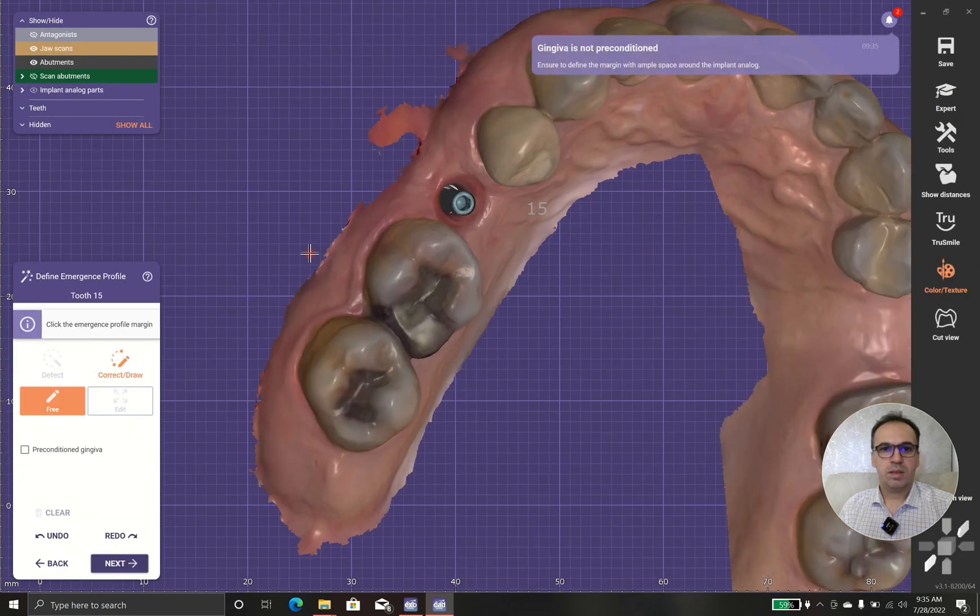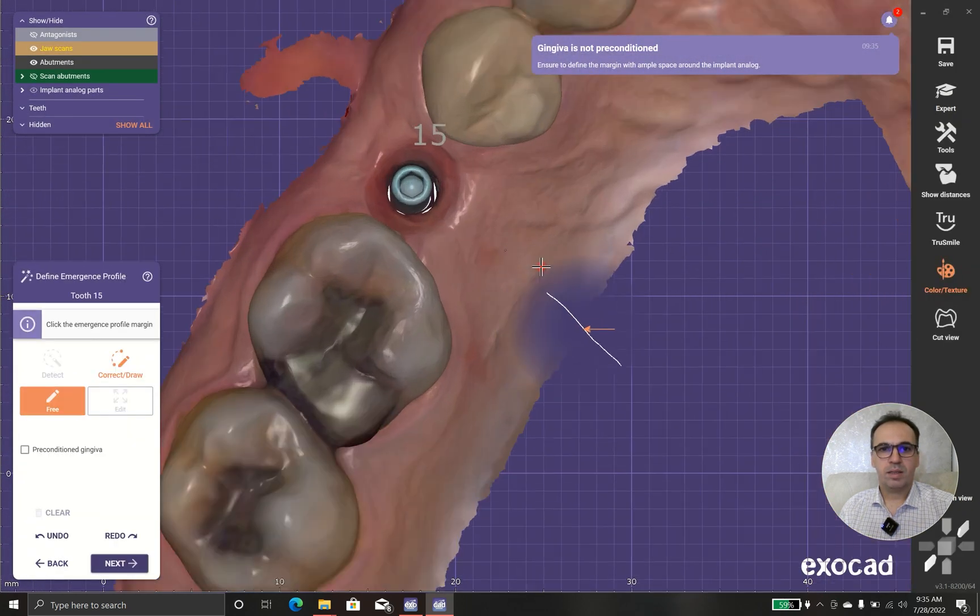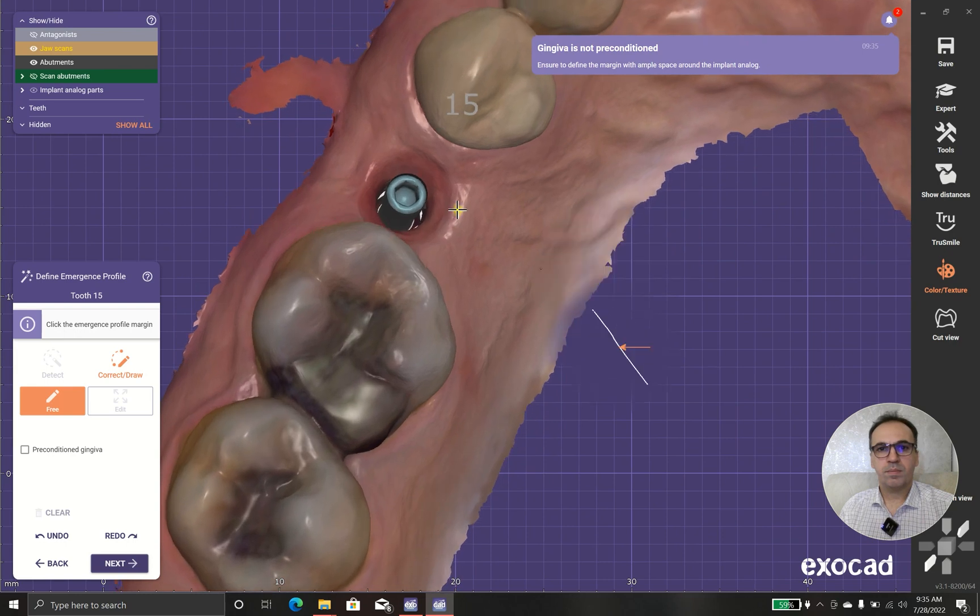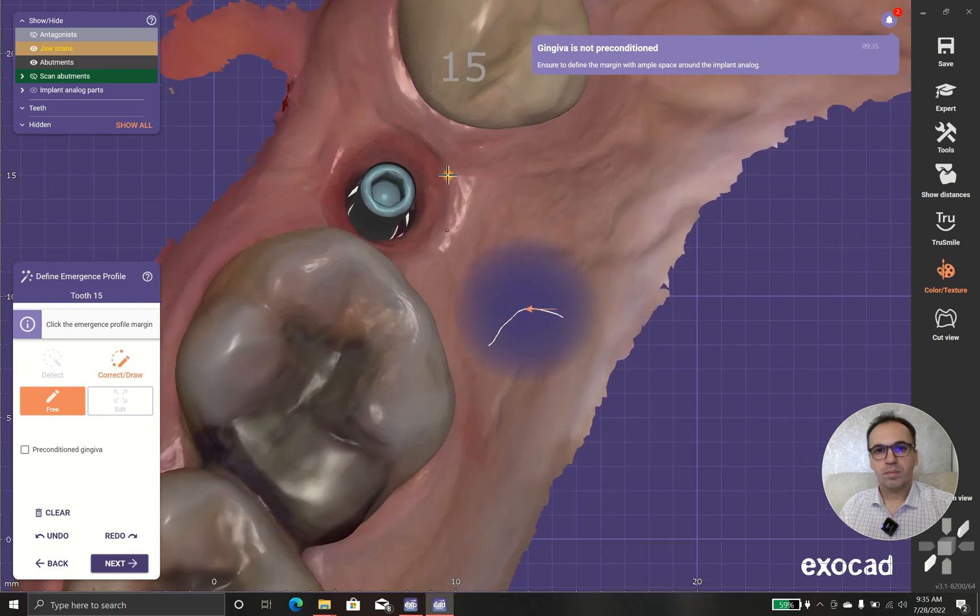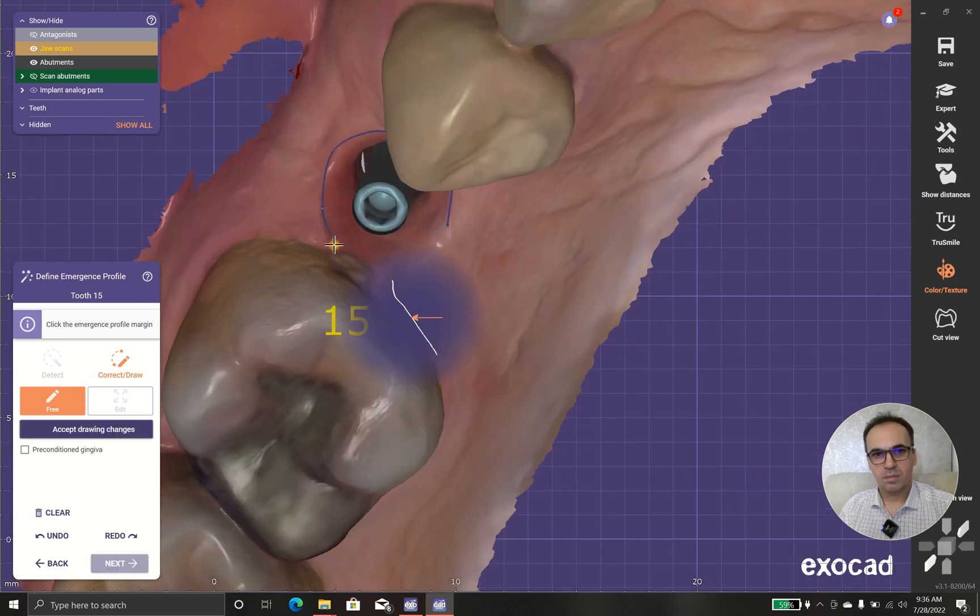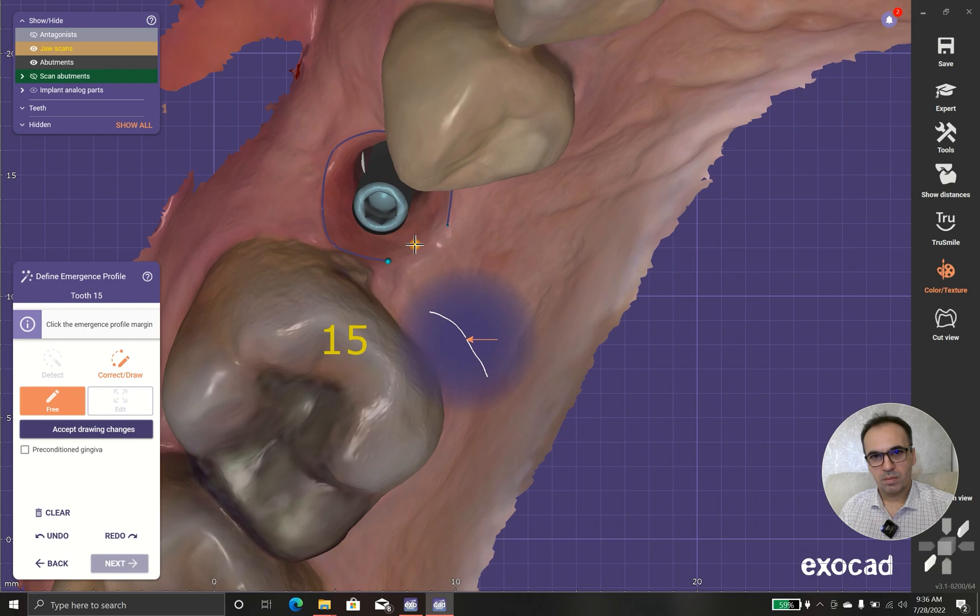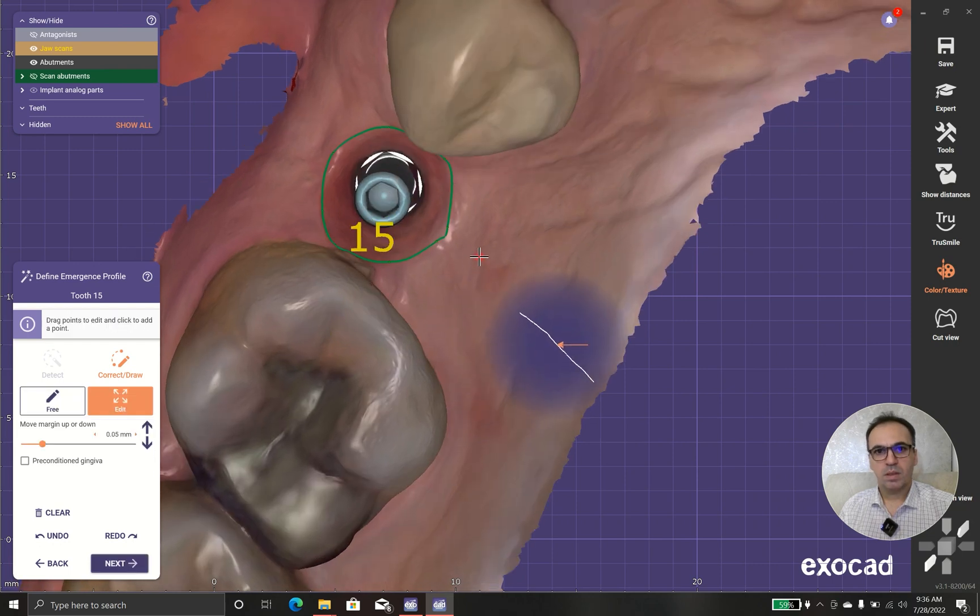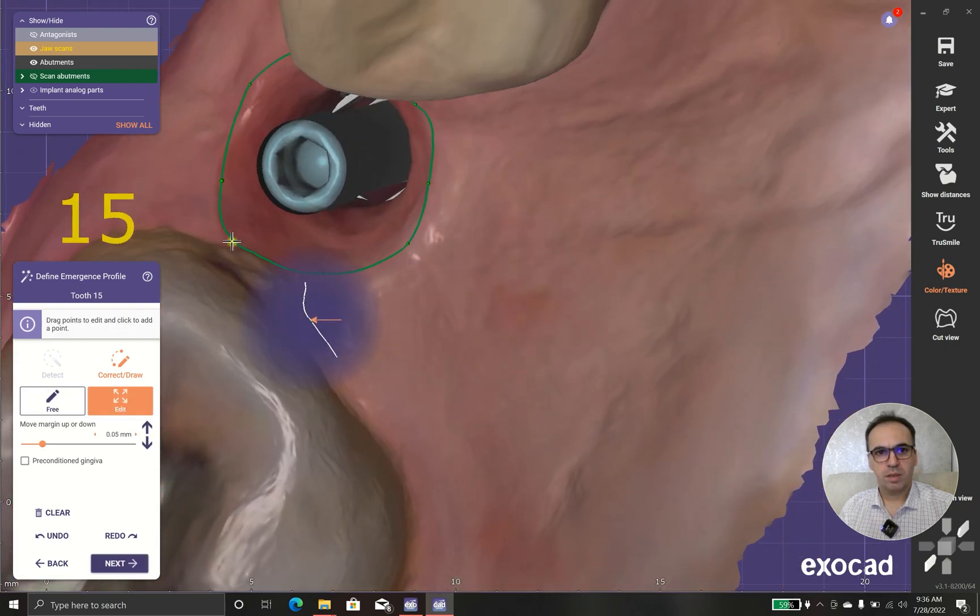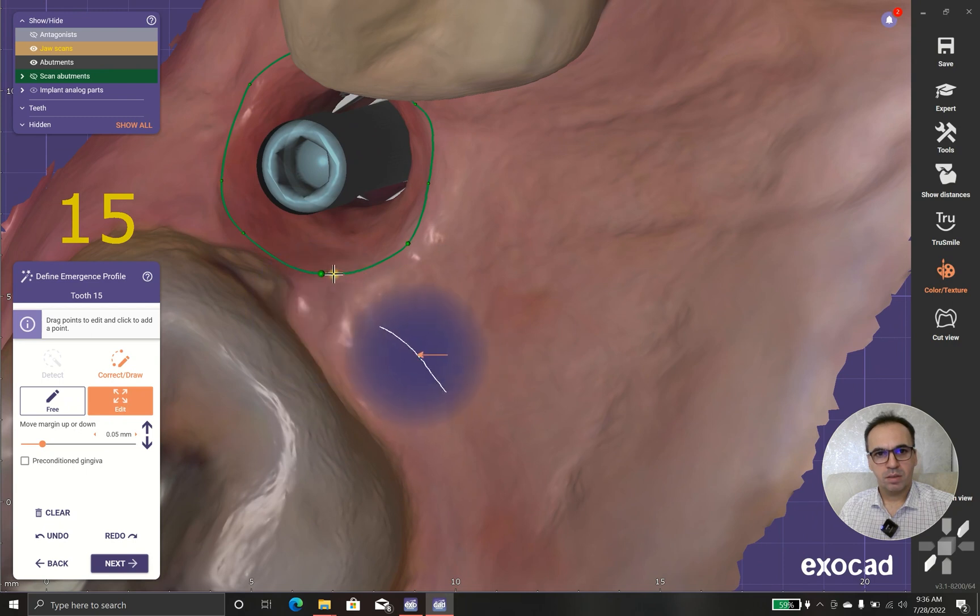And now I want to add emergence data. This shows the software where my margins will be.